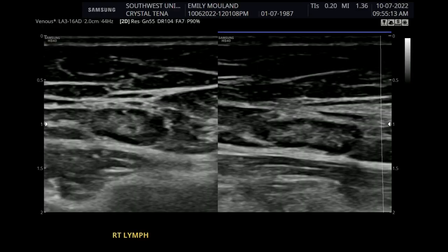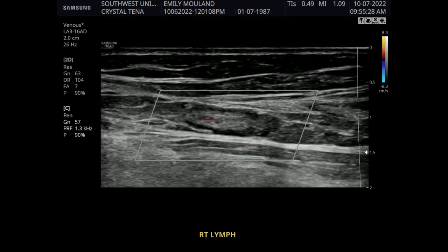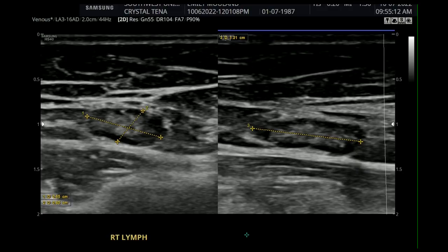The next thing you want to document when doing a lower extremity venous study is the lymph nodes. You're going to find a bunch of lymph nodes in the groin area — some really small ones and also some really big obvious ones. You're definitely going to want to take an image of those also in dual screen, one in sag and one in transverse, get an image in color, and also place a measurement on them.